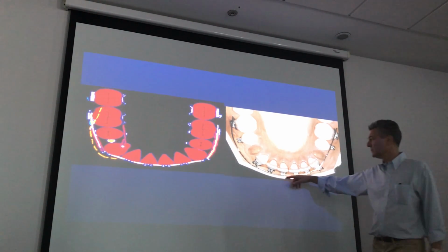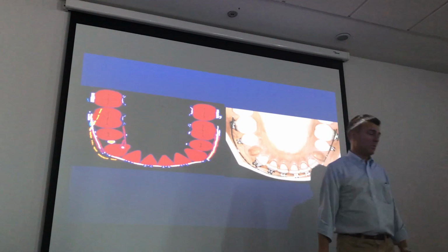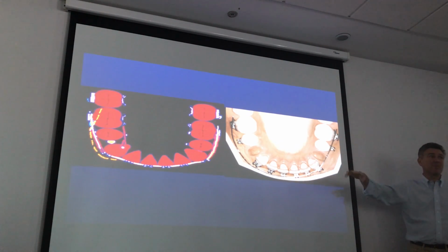Again, the wire has to be bent always wider on one side. When you have an asymmetric situation, you need an asymmetric wire.